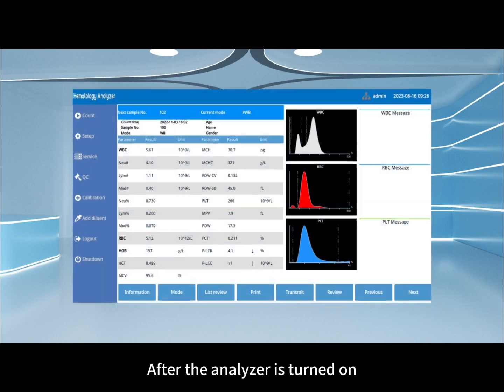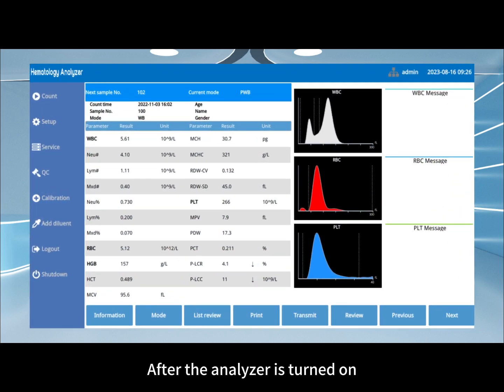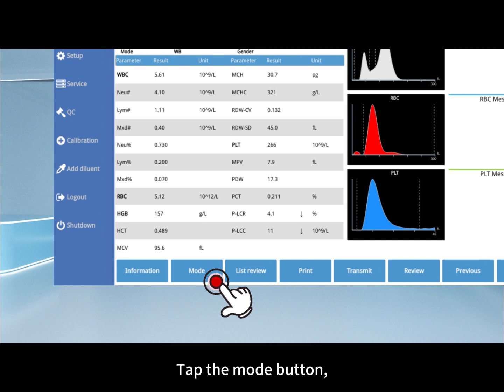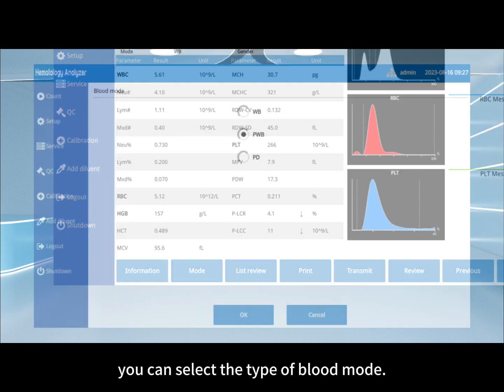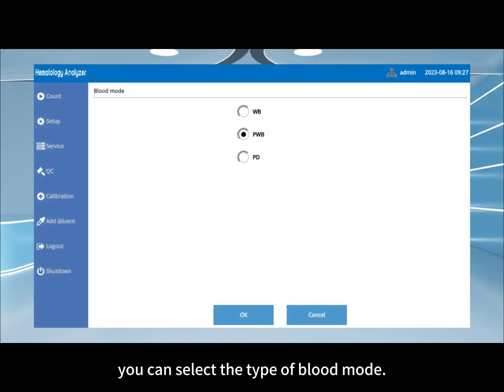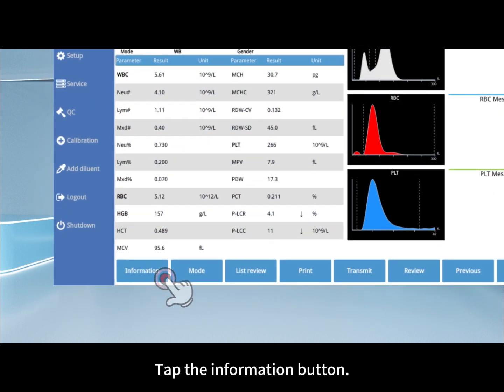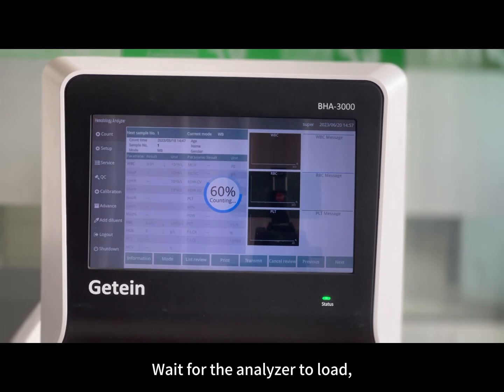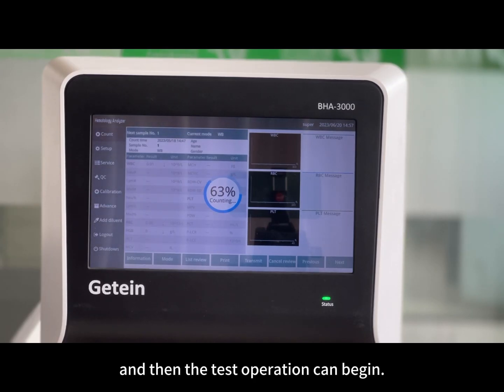After the analyzer is turned on, the interface is shown on screen. Tap the Mode button to select the type of blood mode. Tap the Information button to enter the sample information. Wait for the analyzer to load, and then the test operation can begin.